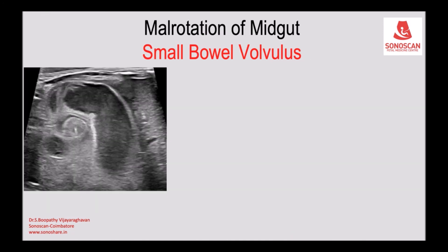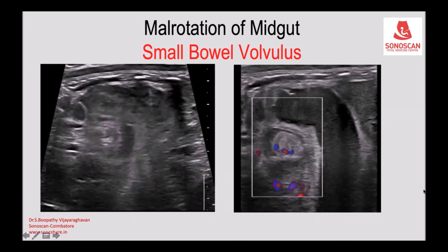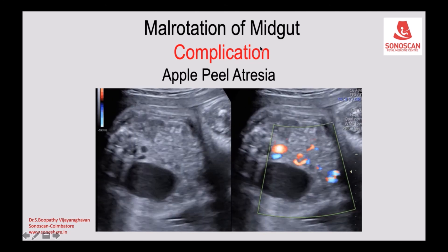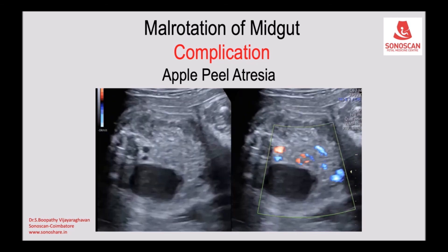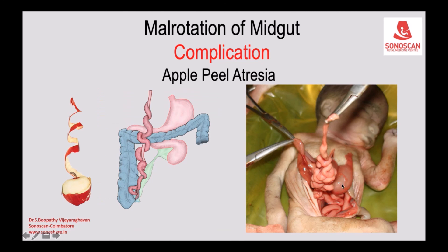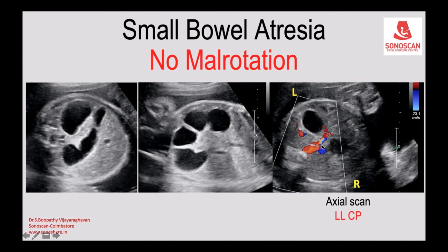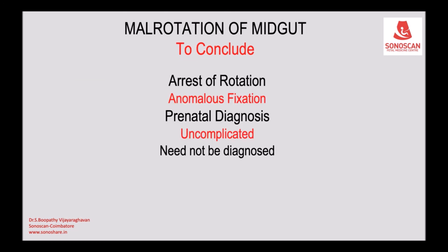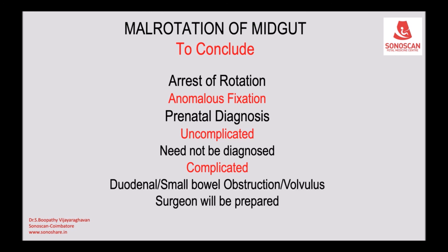Moving the transducer down, you can see the sonographic whirlpool sign both on grayscale and color Doppler. This whirlpool sign indicates volvulus, which in this case is chronic rather than acute. You will see atresia with a massively dilated jejunum, and distal to that the small bowel appears as an apple-peel sign. The superior mesenteric artery is red on the left side and the superior mesenteric vein is blue. When you see one of the three complications — duodenal obstruction, volvulus, or atresia — you should look for malrotation. The diagnostic feature is the superior mesenteric vein on the left side of the superior mesenteric artery.